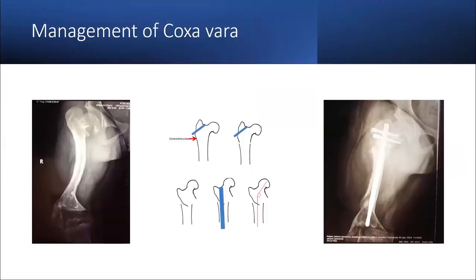So this is a patient who has coxa vara, for example. This procedure would be carried out using a standard open lateral approach to the hip. You create a track for the nail, which would be the blue line there, and then identify the osteotomy location under direct vision, complete your bone section, reduce the distal fragment in relation to the proximal fragment, and then introduce your implant. In this case, we use the SIGN fin nail, which does not require intraoperative imaging. And then you get your outcome. So you restore the neck shaft angle.